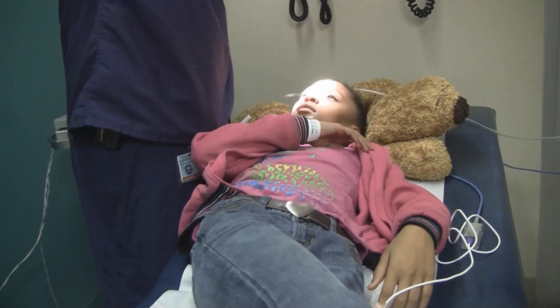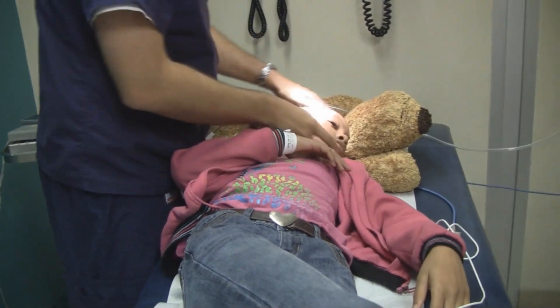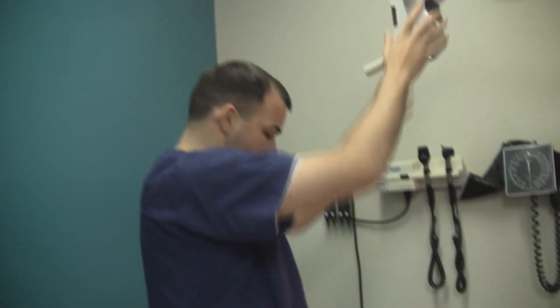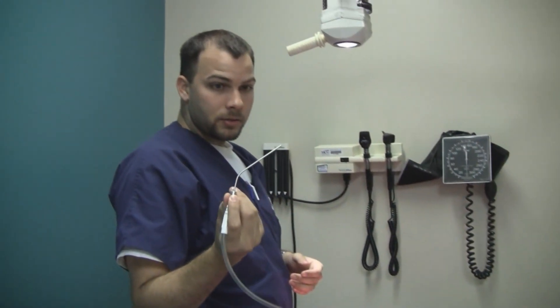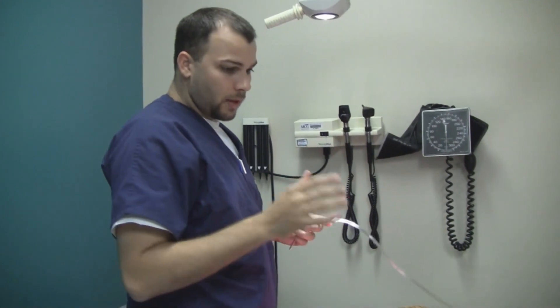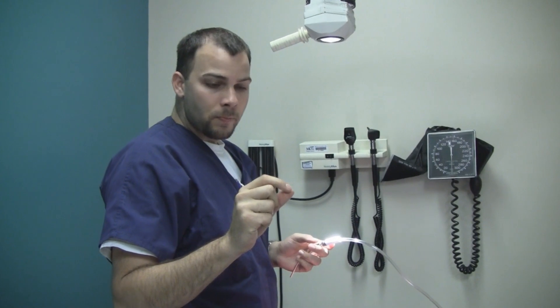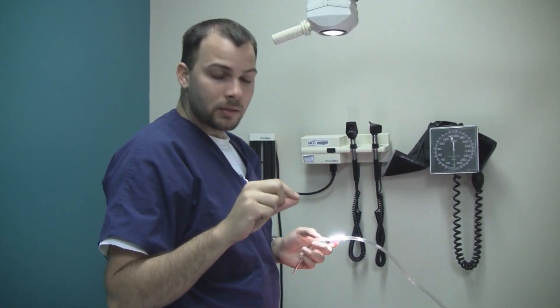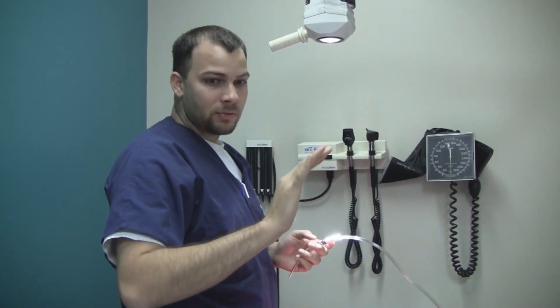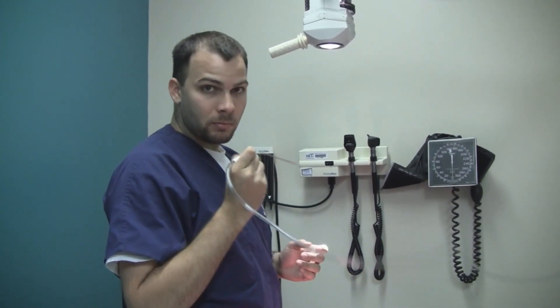We tried earlier to remove it without success, so we're going to try a couple things. We have a suction tip designed for the ears. We can easily see and visualize the eraser; however, its orientation made it such that we couldn't actually grab it. It has a rather broad-based, flat surface facing up towards us, which is why we couldn't grab it. We're hoping we can touch it with the suction and extract it.